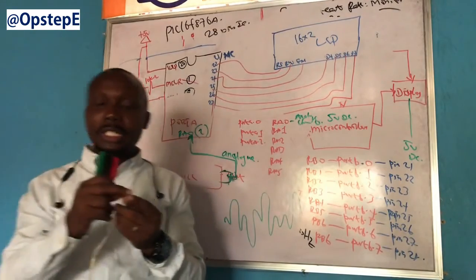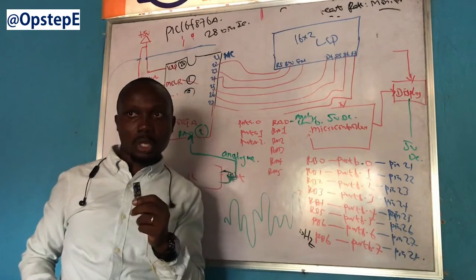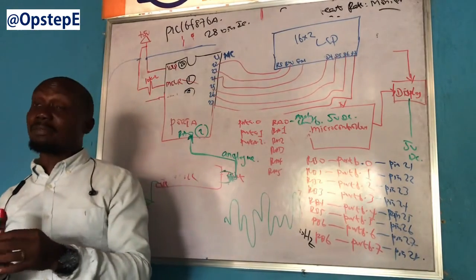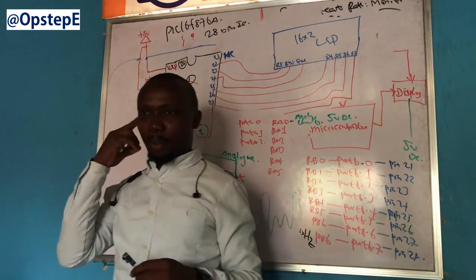Now don't forget, on this board is the microphone itself and the preamp stage. What is not on this board is the filter stage. From all that I've gathered two weeks ago, starting this year, we have a problem with that filter stage.